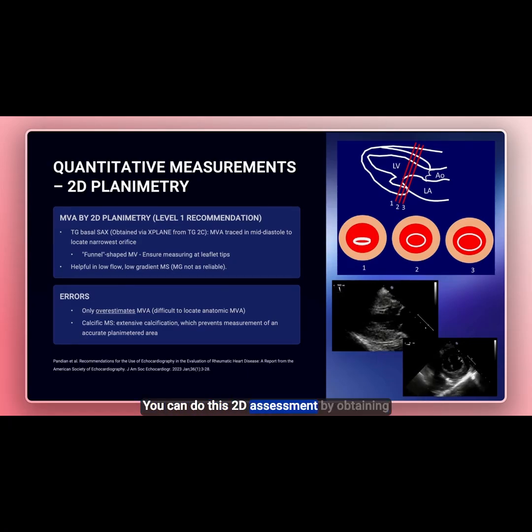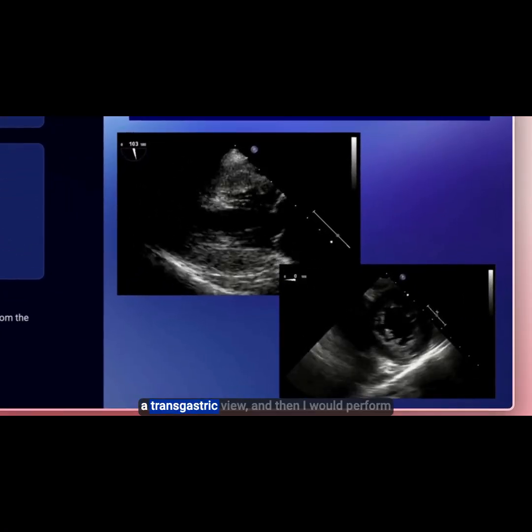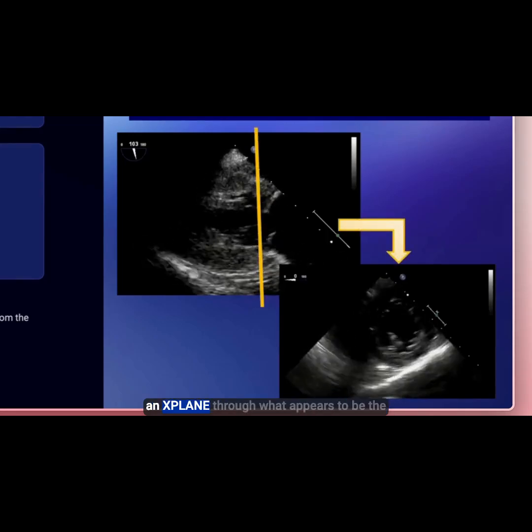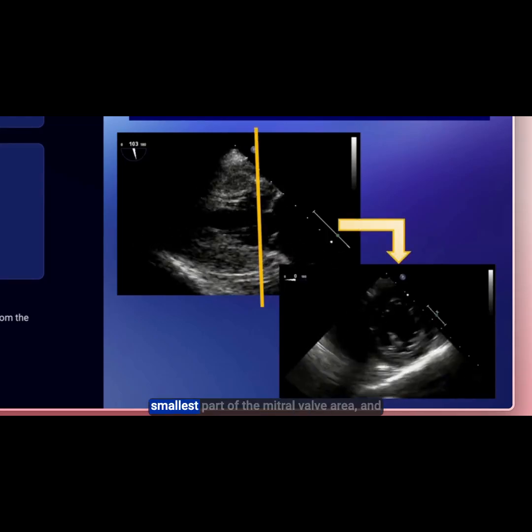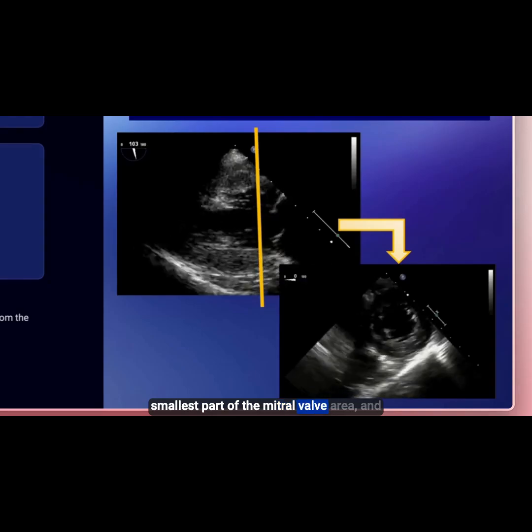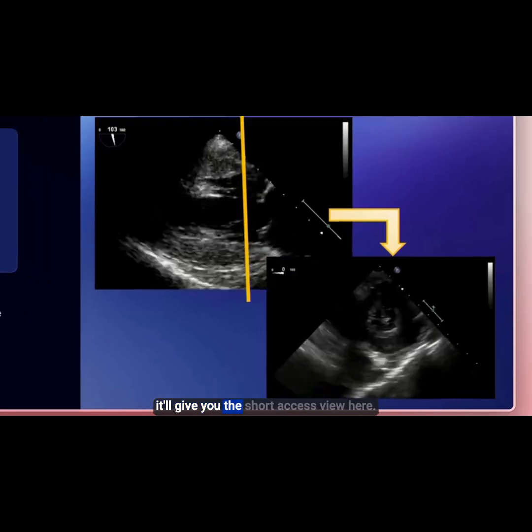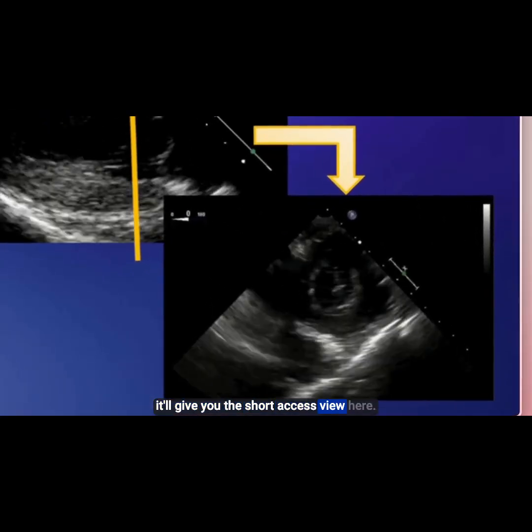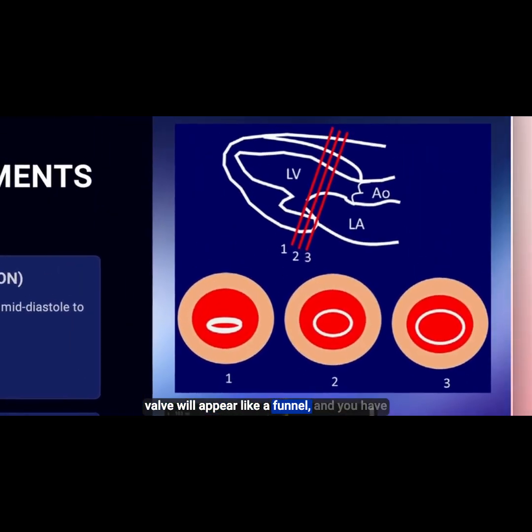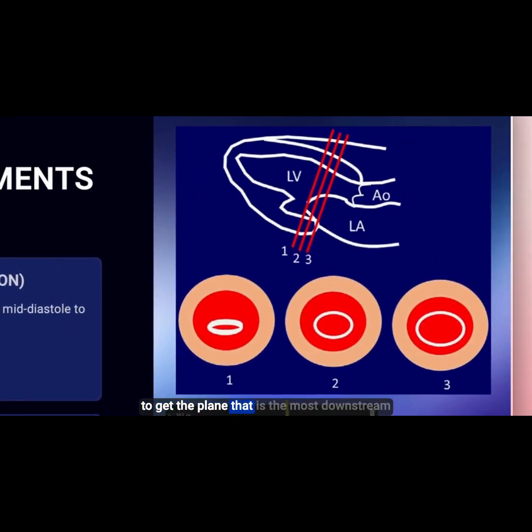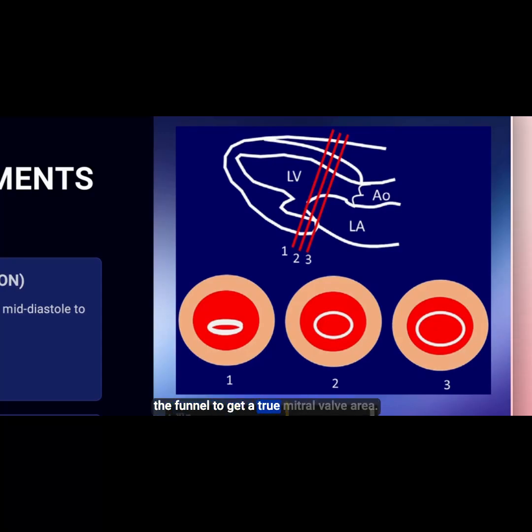You can do this 2D assessment by obtaining a transgastric view, and then performing an X-plane through what appears to be the smallest part of the mitral valve area, which will give you the short axis view. The mitral valve will appear like a funnel, and you have to get the plane that is most downstream on the mitral valve — the smallest part of the funnel — to get a true mitral valve area.